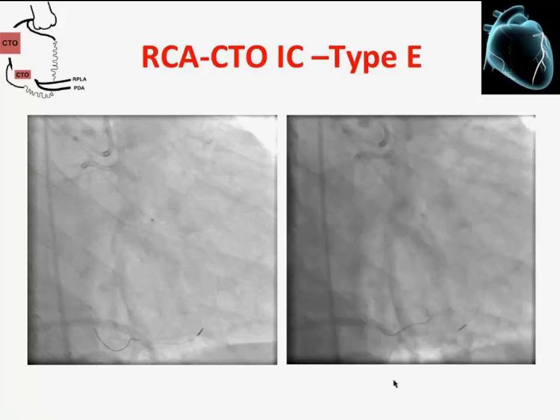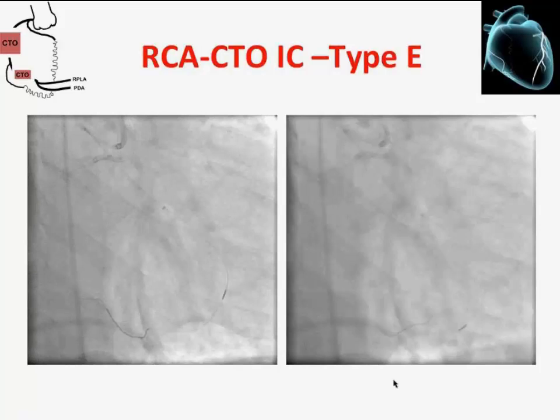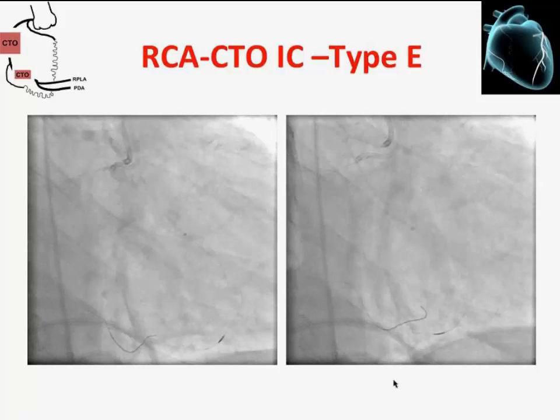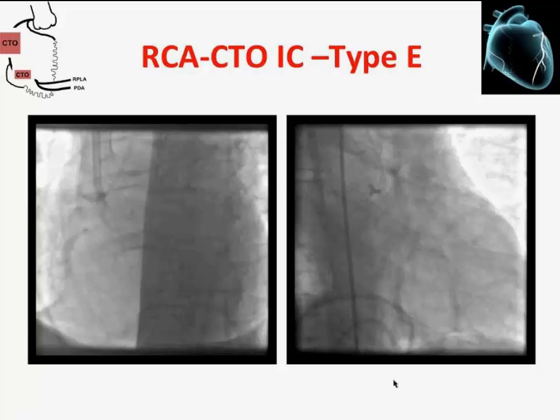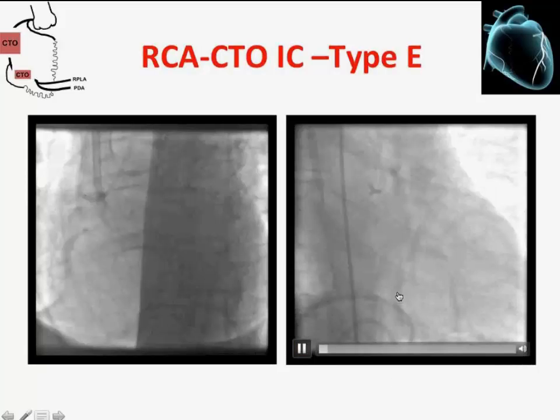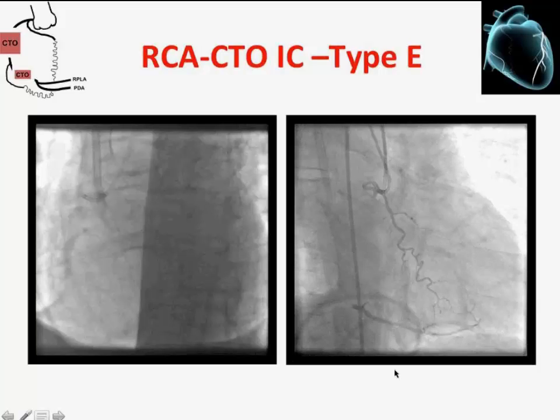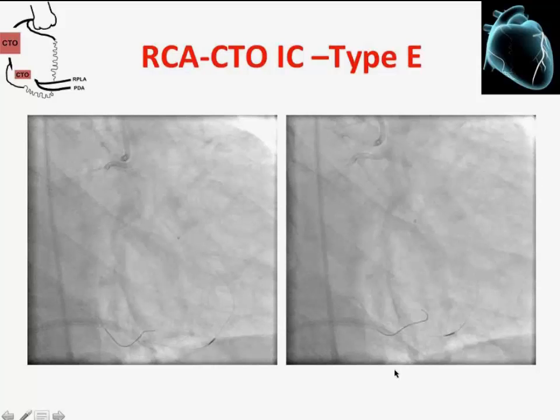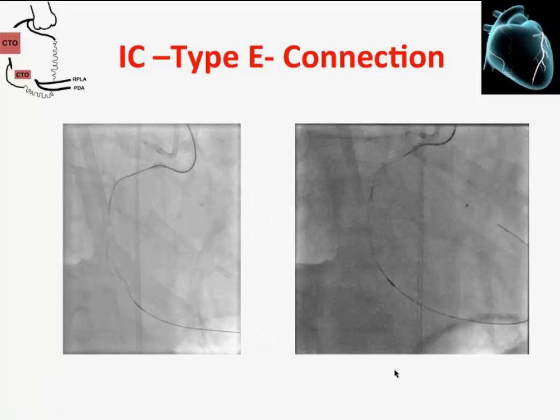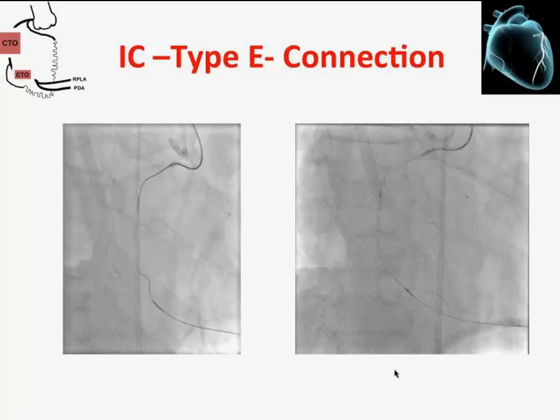So I tried to go directly retrograde in this case. I put a mother and child catheter. In this case, it was a Cyan black and Enhancer microcatheter, and I could pass this very, very tiny epicardial. When I go one back, I can show it to you again. It was this epicardial connection, as you can see here. Yeah. So again, we have to be very, very careful regarding rupture. So it's not the microcatheter and not the wire which destroy this epicardial, but it's the shear stress when you do stenting over an externalized wire.